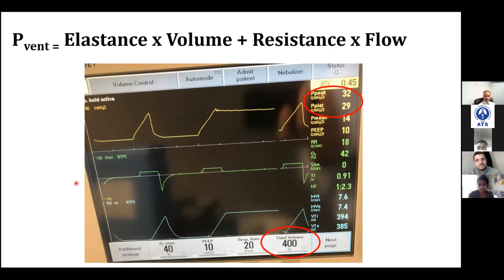What's our magic number? 30. 30, right? So we're below 30. Woohoo! Okay, so we're below our safe line here. Lower the better, but 29 is better than 34. All right. Now, what else changed?